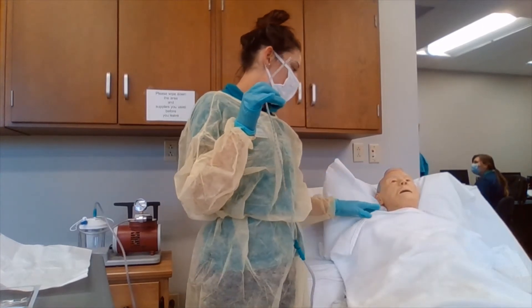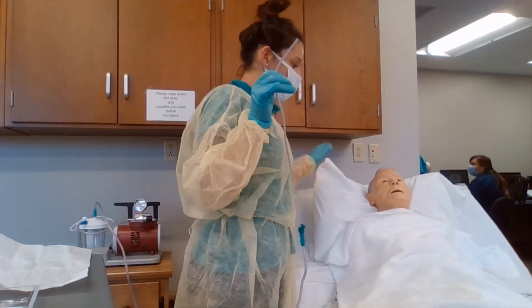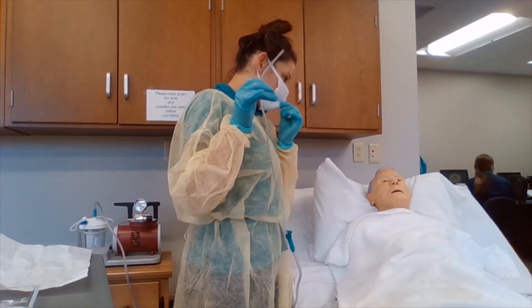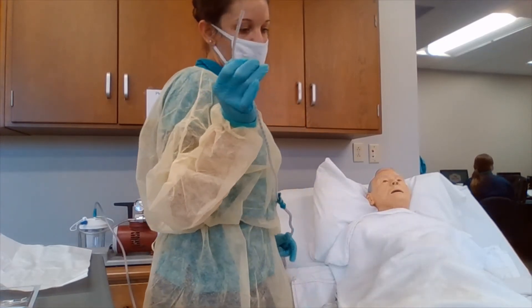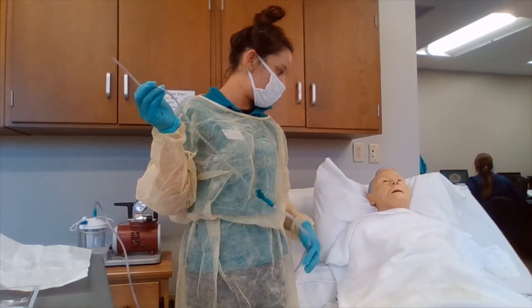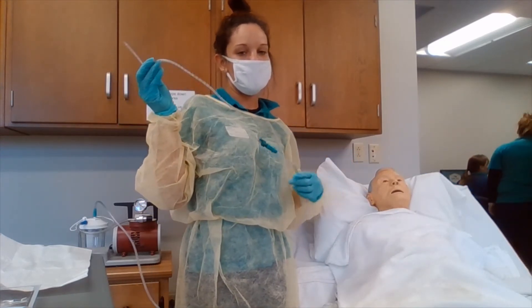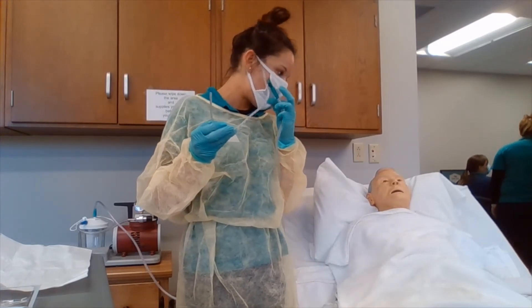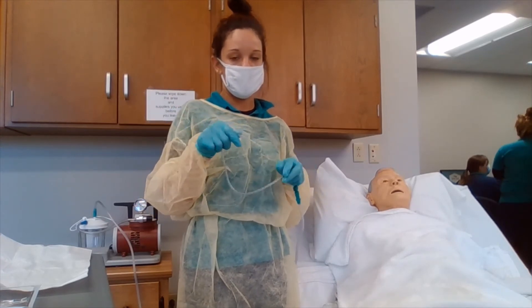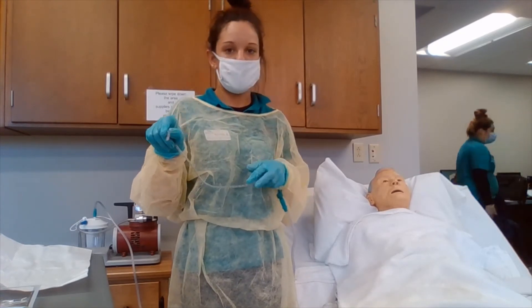If the patient is using oxygen, we are going to be removing the oxygen device with our non-dominant hand. We are also going to be assessing the SpO2 level. If it drops below 94% or there are symptoms of distress, we are going to give supplemental oxygen before suctioning, during suctioning, in between suction passes, and after the procedure is done.